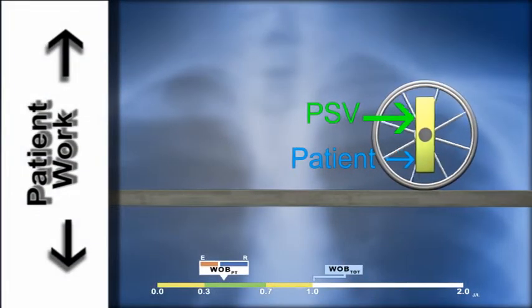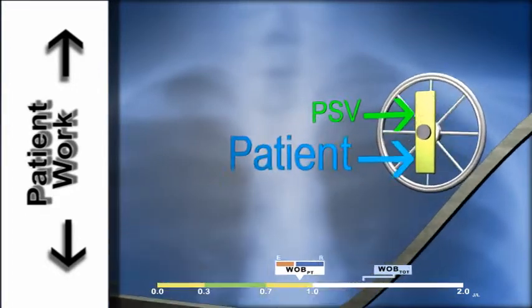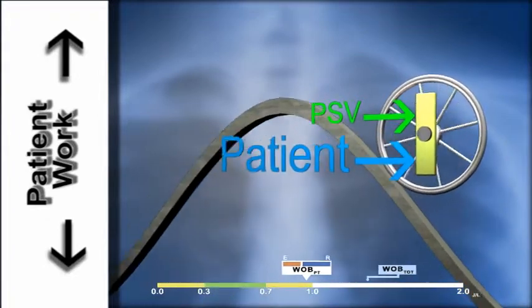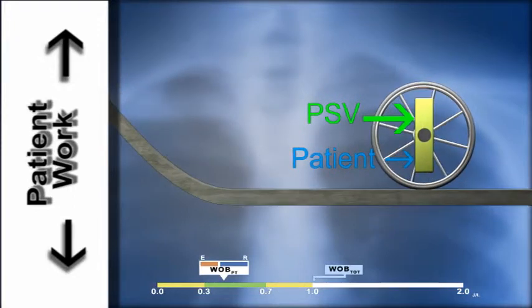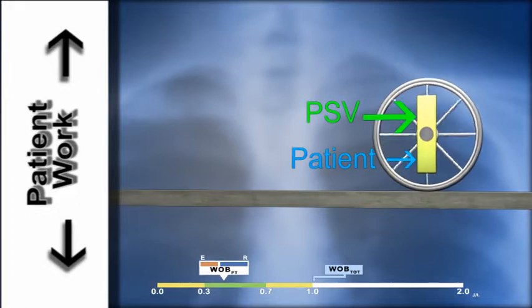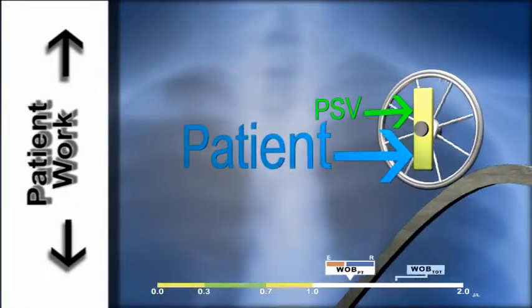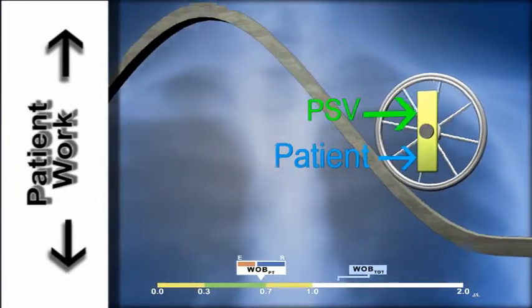Mechanically ventilated patients will face a number of variables that will increase their workload, such as metabolic changes, anxiety, temperature, and pain. As the patient faces these additional challenges of work, note that with pressure support in the face of a changing environment, the preset pressure is unchanging and the balance of work is shifted to the patient as illustrated by changes in font size of the letters.